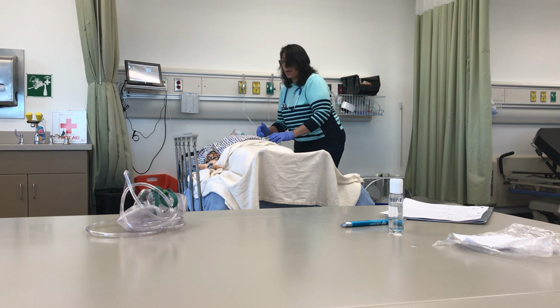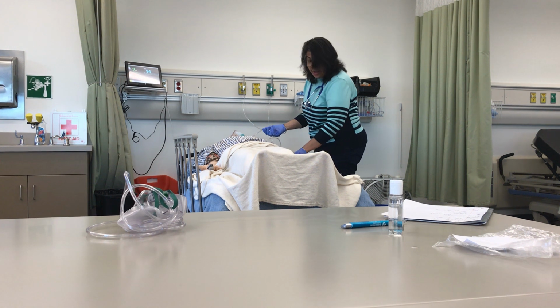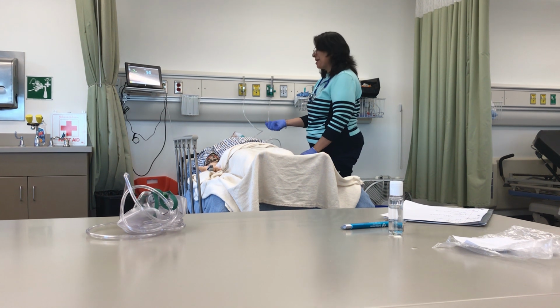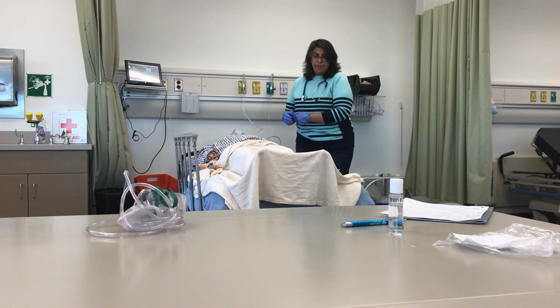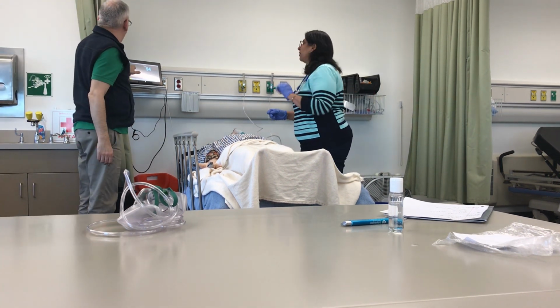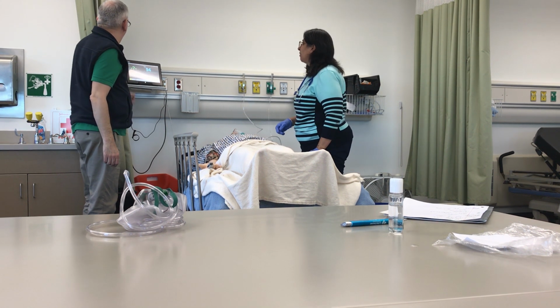So in the meantime, while I was listening to his breath sounds, I counted his respiratory rate, which is about, I would say, 28. I have my nap going, and there's a couple of funny things about the monitor here. If we hit this, it'll start giving us a number there, and then if we touch this, it'll give us a blood pressure.